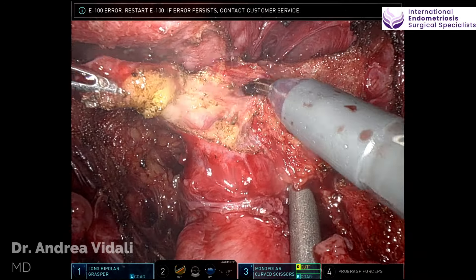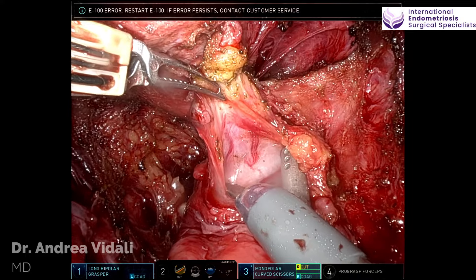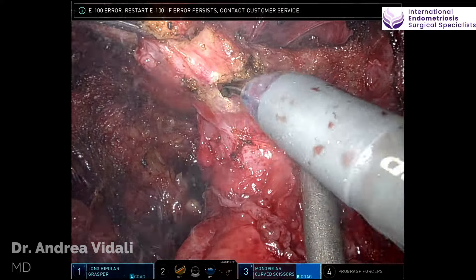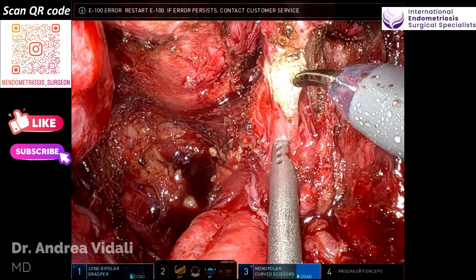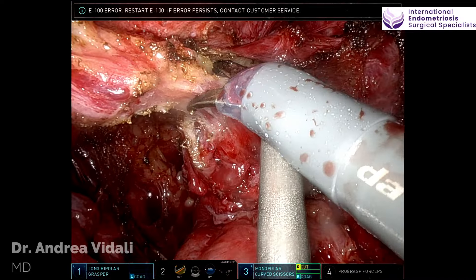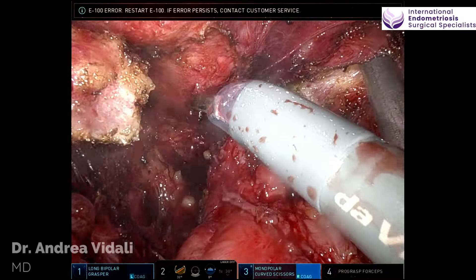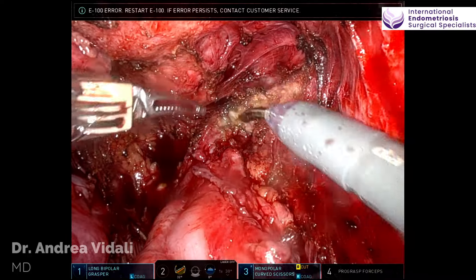You could see that the fat certainly does not look normal. The assistant is helping with suction and very little irrigation, because I really don't like to use large amounts of irrigation during dissection of a large right pararectal nodule at the corner with the utero-sacral ligament. I mostly use the monopolar scissor as closed, almost as if I was using a hook, but with the benefit of better mobility.